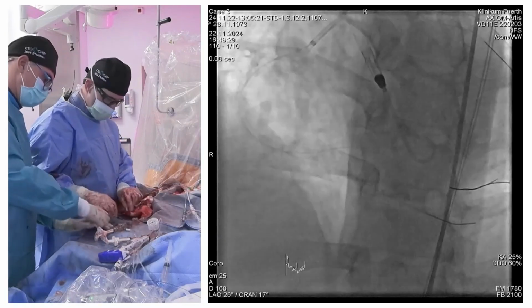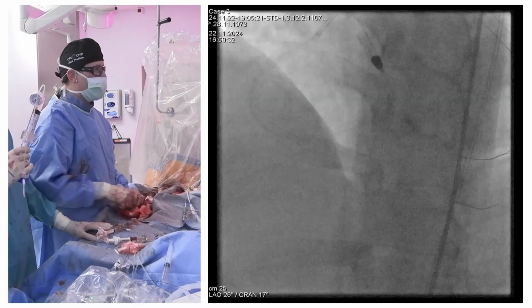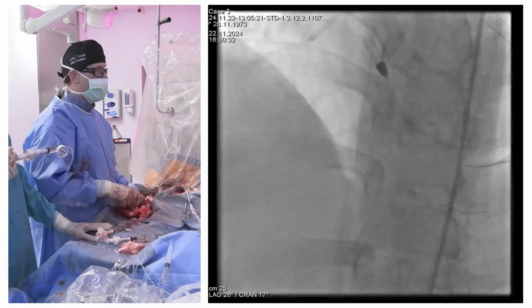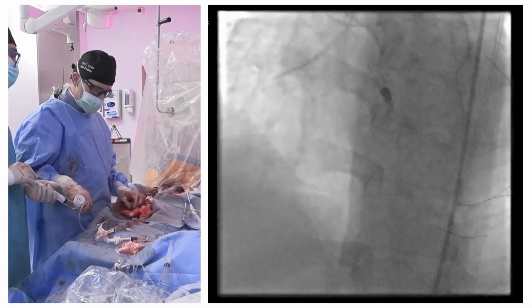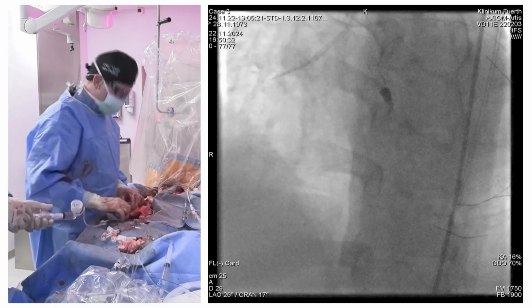So I think I'm a big fan, or let's say the other way around, I'm a big fan of having another look a little later on and check if whatever we have done looks like or is going to be a long-lasting thing. I think that's a wise approach, yeah.